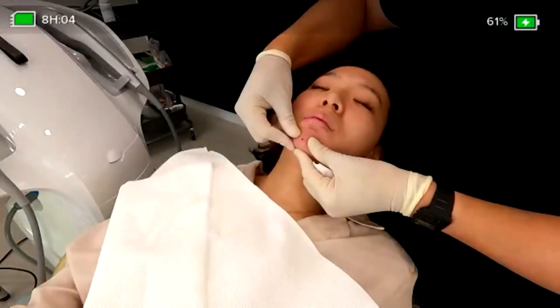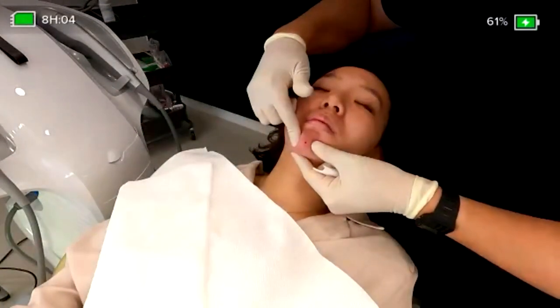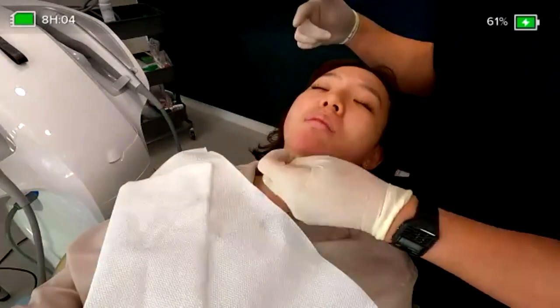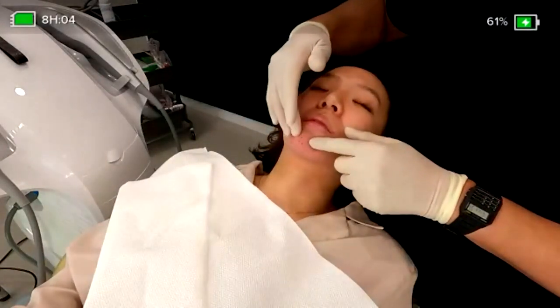In these cases, the molding is not always easy when you are making the injection. So please select the proper filler to make the patient satisfied.